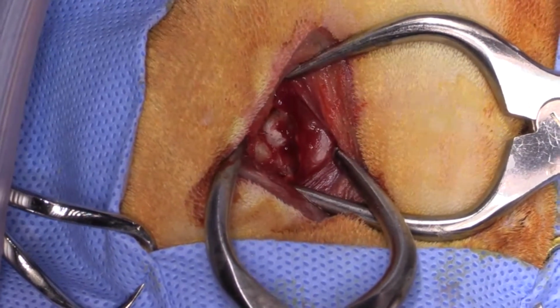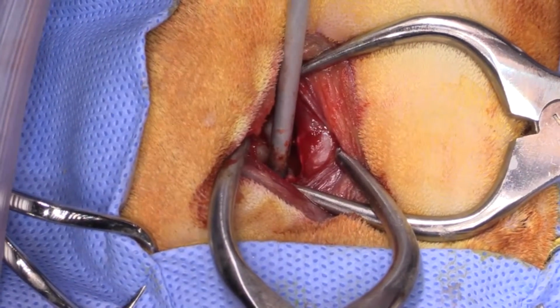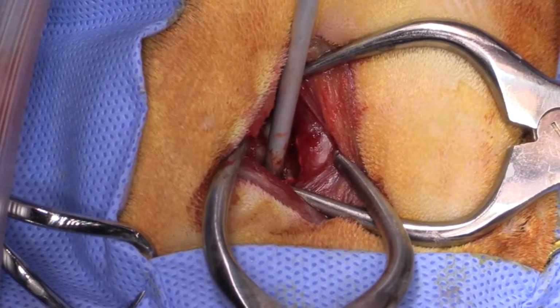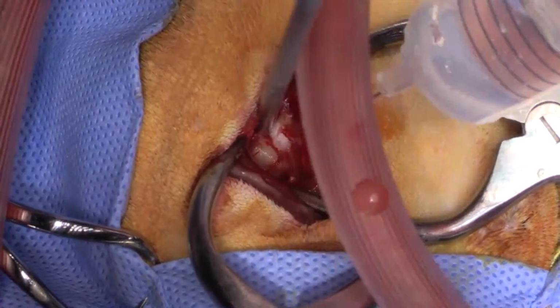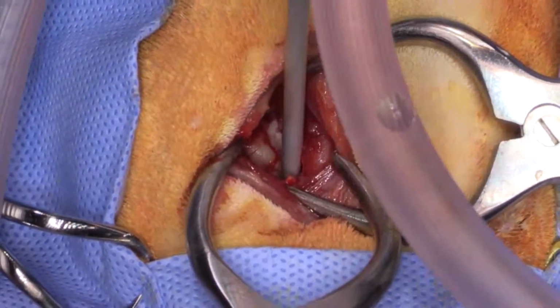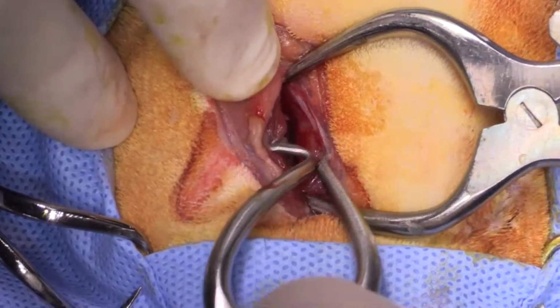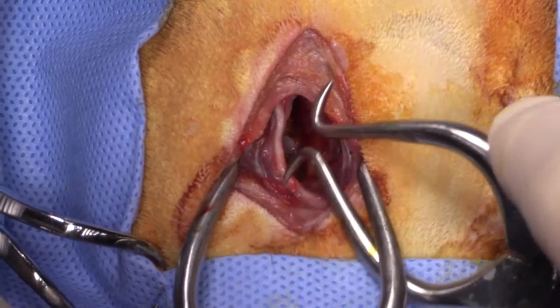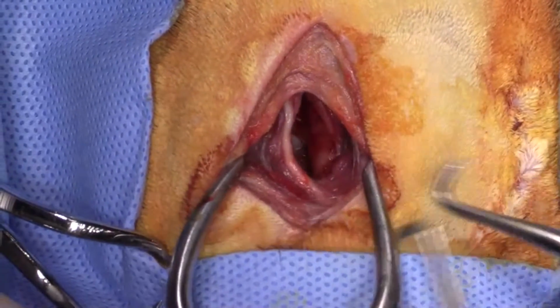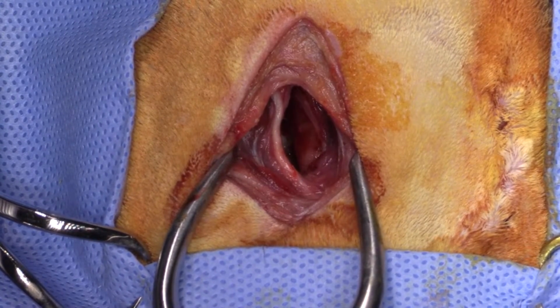So we'll just flush that out, please. Now that's good. All right. So we are done. Goes back to our glossopharyngeal nerve there. Just be very careful with that when I close. Get back to my 4.0 PDS, please. The purple.